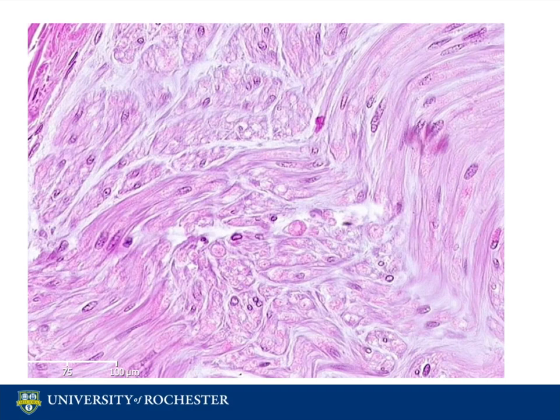At high magnification, we can clearly see a number of nuclei within the fascicles. However, these nuclei do not belong to the neurons. They belong to the Schwann cells that encapsulate the axons of each neuron. The Schwann cells are rich in myelin and form a myelin sheath which acts to insulate the axon so that the action potential can propagate more quickly. This myelin sheath is in turn covered by the last surrounding layer of connective tissue, the endoneurium.